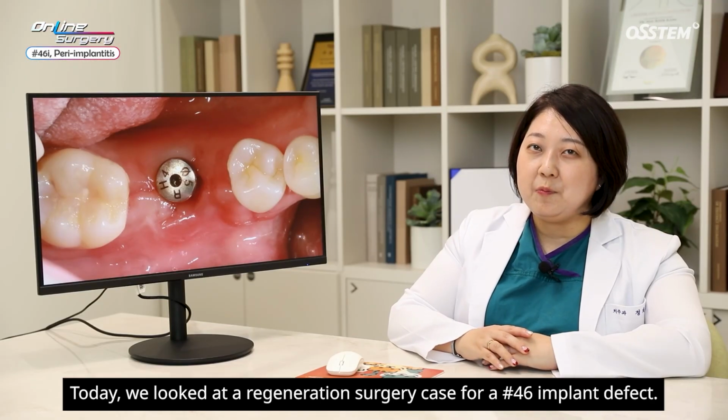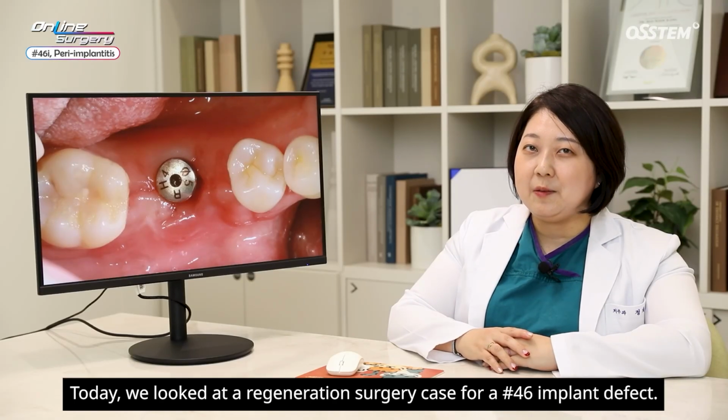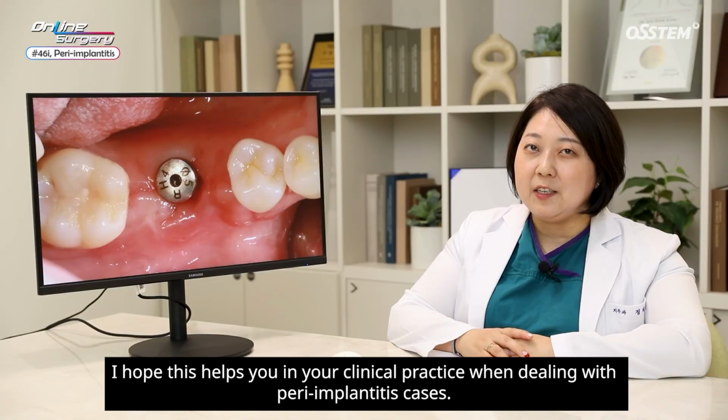Today we looked at a regeneration surgery case for a number 46 implant defect. I hope this helps you in your clinical practice when dealing with peri-implantitis cases.